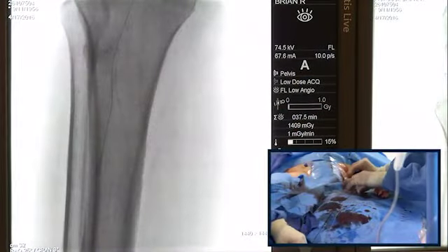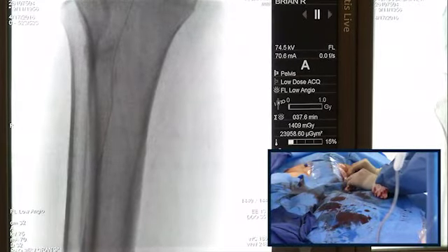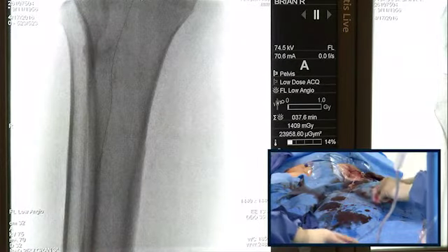It's very tight. The system is very tight. So let us give it some ballooning. Now, obviously, I know Thomas already mentioned Supera. So one of the challenges is that we have to really prep this vessel, as you all know. Let us go with a 5 and then decide what we want to do.